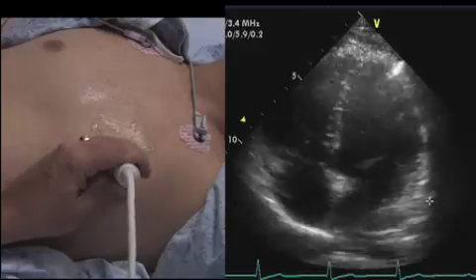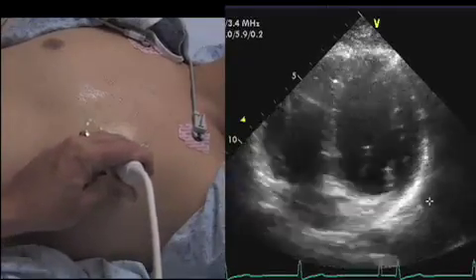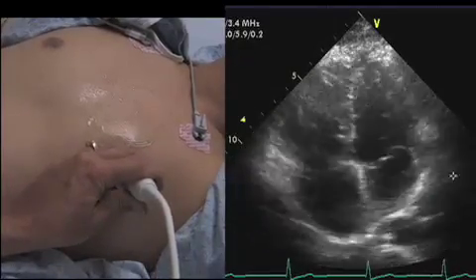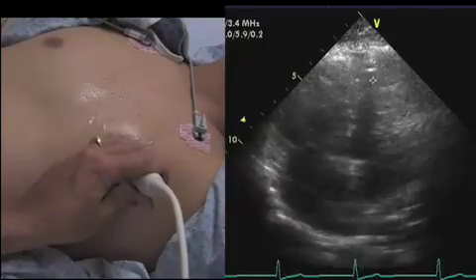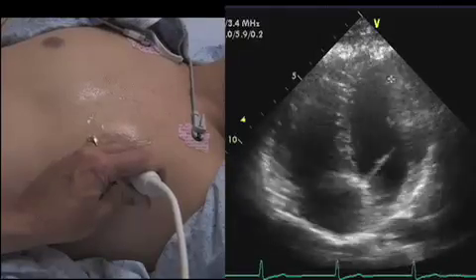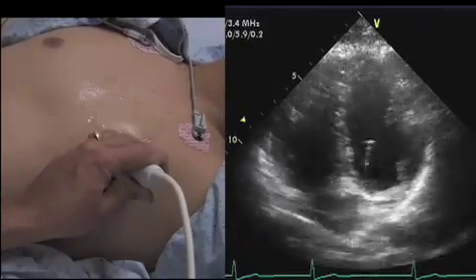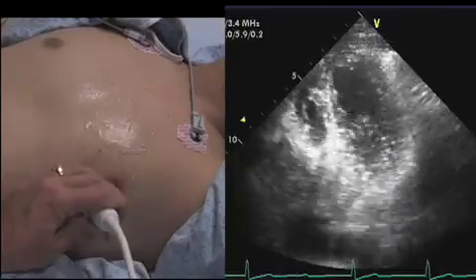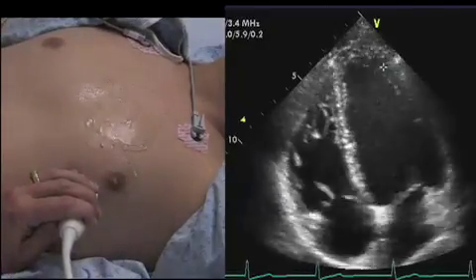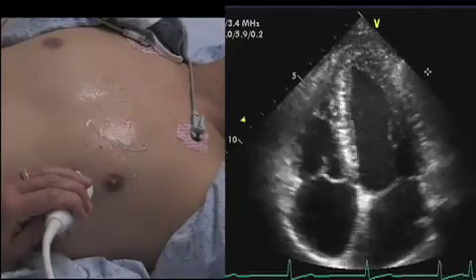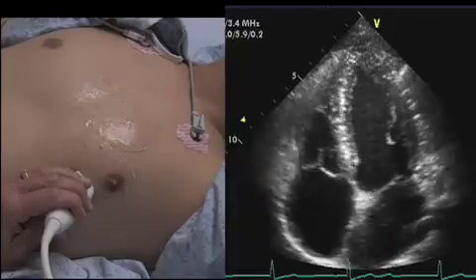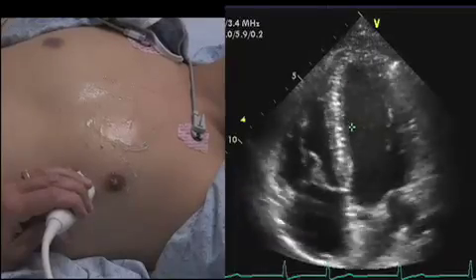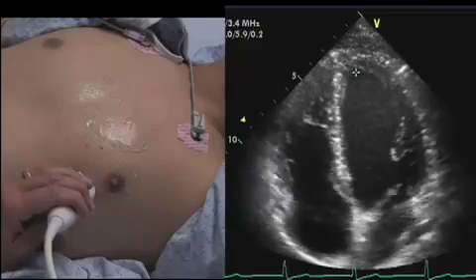It's very easy to have a foreshortened apical view. Here's somewhat of an example — it happens quite often. You see the apex here is not coming to a point; you want the apex almost to be pinching off. Here it seems to be coming in almost as if it's a short axis, meaning we're foreshortening the apex. To fix this, you need to find a lower window and angle steeper — angle higher up into the chest to open up the apex.